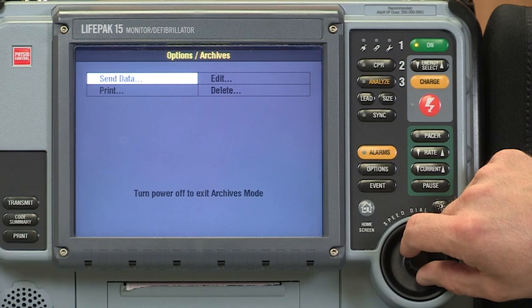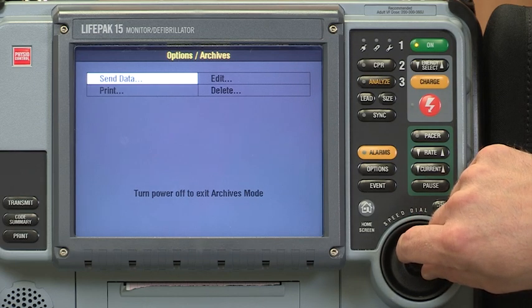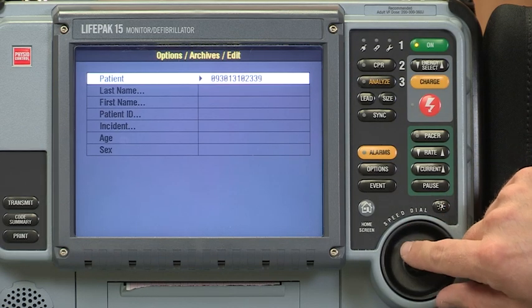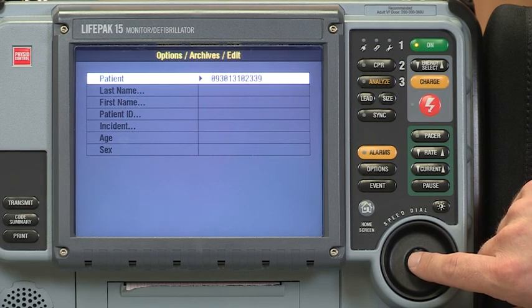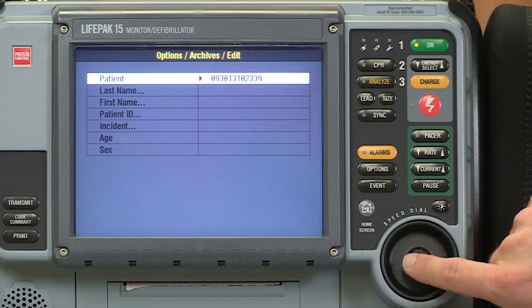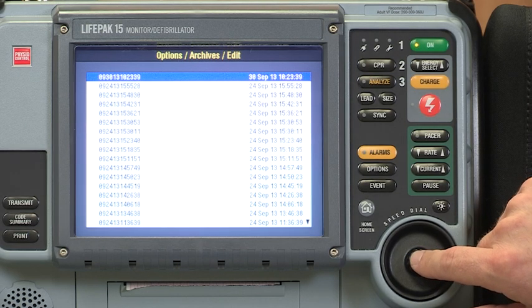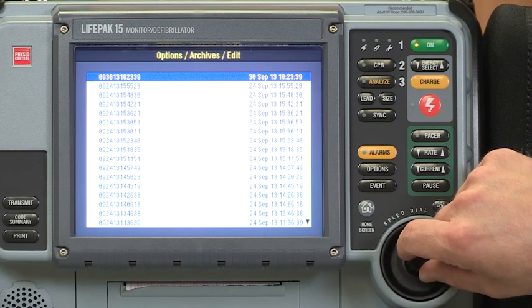Once we get to the Options Archives menu screen, we want to edit our data first before we send the data. You'll see the patient's edit screen pops up with patient last name, first name. We always just want to select the first one that pops up. That was the last event that was recorded on the machine the last time the machine was turned on.